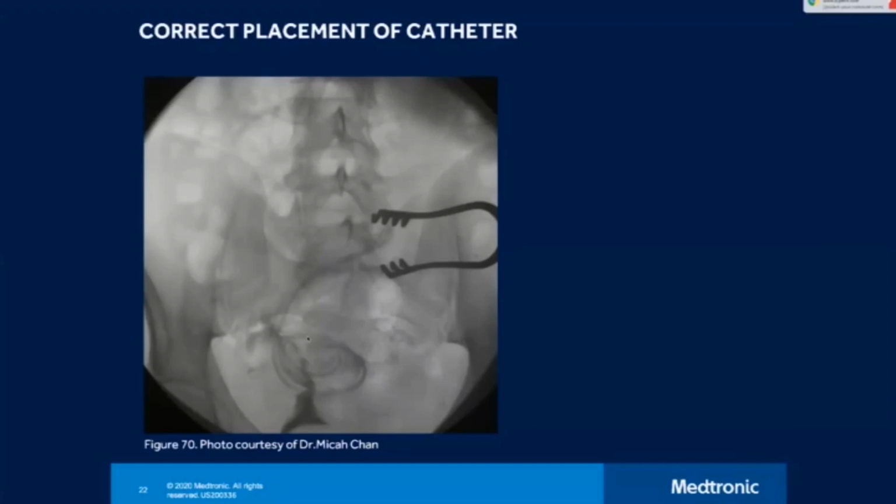And so really one of the big ways to increase peritoneal dialysis is for interventionalists to do it. Many colleagues and people that I don't know across the country are asking about training for placing PD catheters, because nephrologists are referring more and more to interventional radiology to place these catheters. So I think what's important is just to place the catheter right, just to get experience. If you haven't done it, you just have to try it and do it.